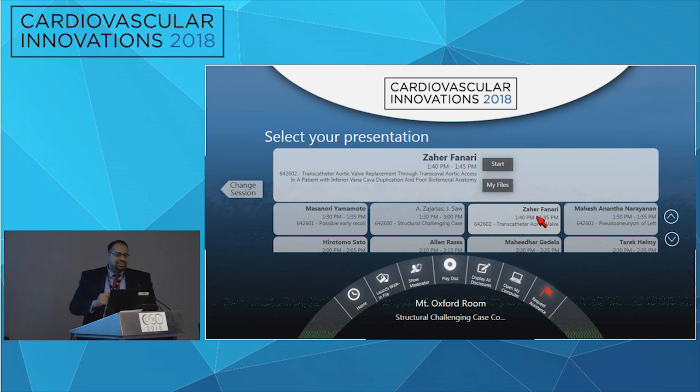I just learned transcaval cases because Dr. Greenbaum was at our institution and taught us. One thing he said is that 30–40% of people will have that flow, which is intentional, right? So the first question would be, why did you think you needed to post that?